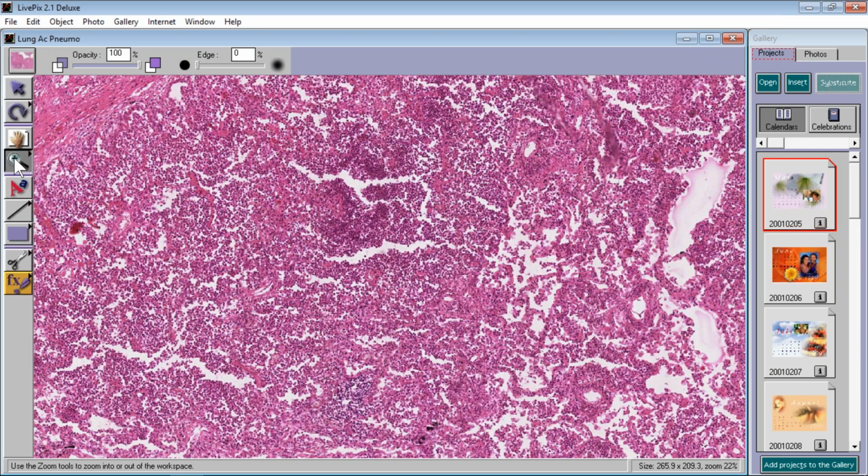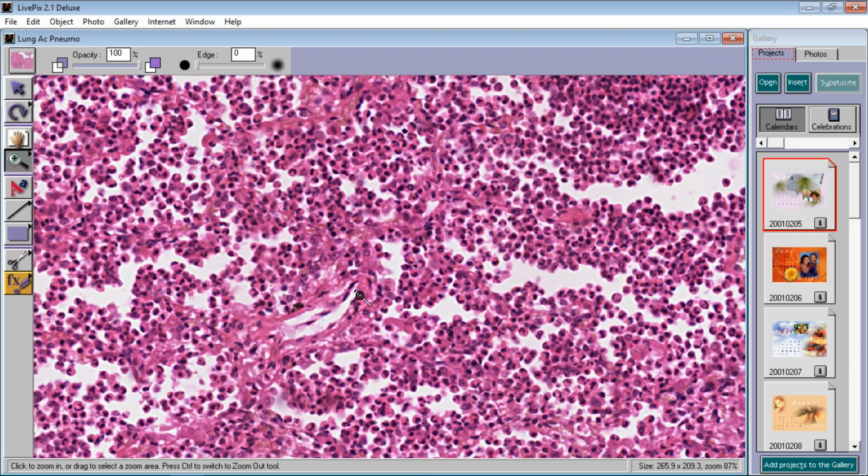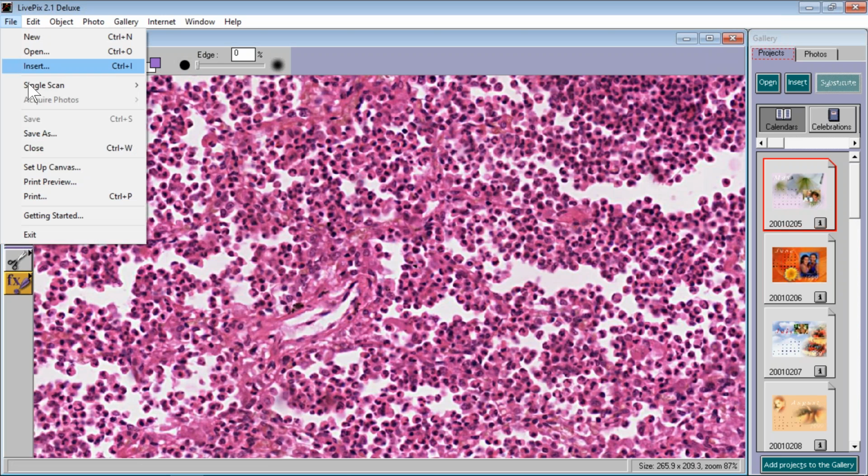This is a microabscess. Why am I calling it a microabscess? Because it might not be big enough for you to see with your naked eye. If it was, then you would just call it an abscess. But if you call it a microabscess, it's probably going to be an abscess that you could see predominantly with your microscope. Look, 100% neutrophils. That's an abscess. That's what every abscess in the world looks like, no matter where it is.